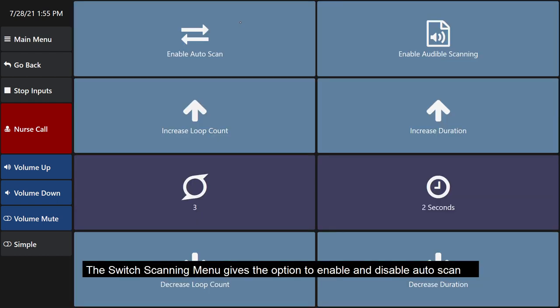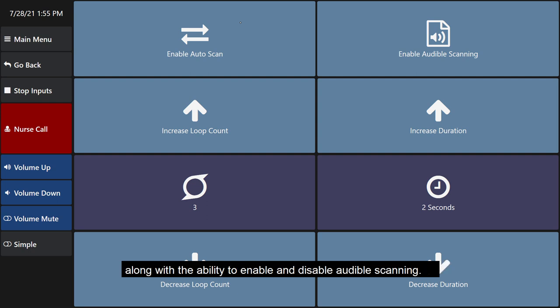The switch scanning menu gives the option to enable and disable auto scan along with the ability to enable and disable audible scanning.